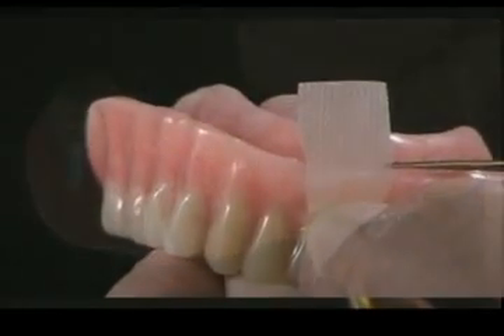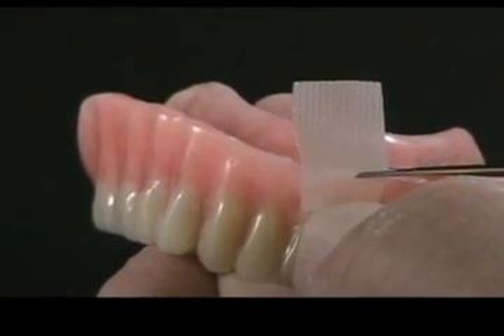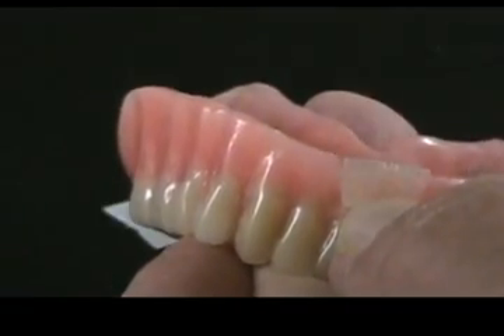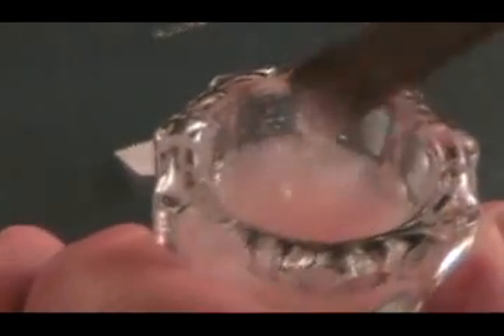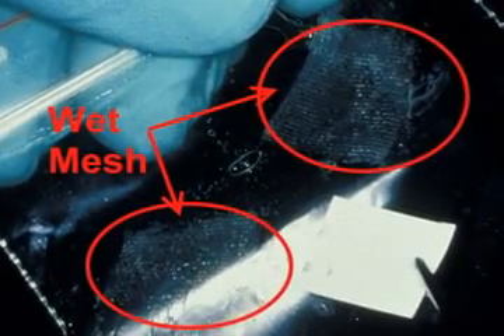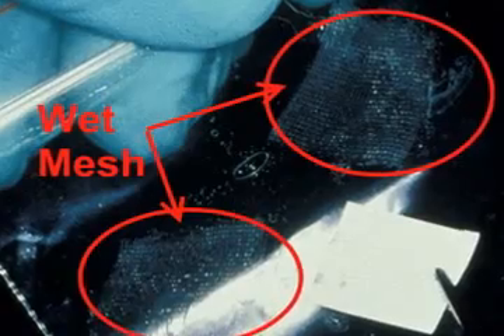Measure and, using regular scissors, cut two small pieces of Permamesh to fit the area to be repaired or reinforced. Make a very thin slurry mix of self-cure powder and liquid. Pour the thin slurry mix over the pieces of Permamesh to activate or wet the fibers — the Permamesh becomes translucent.